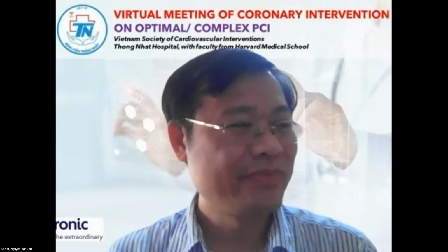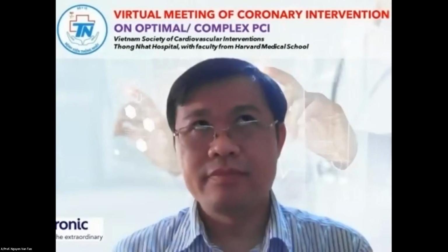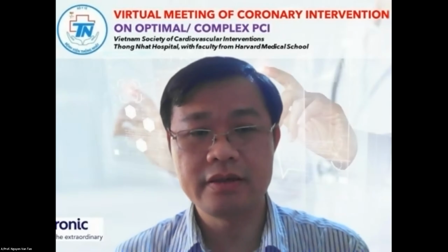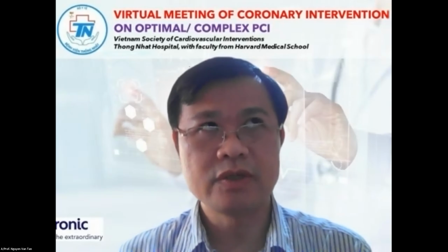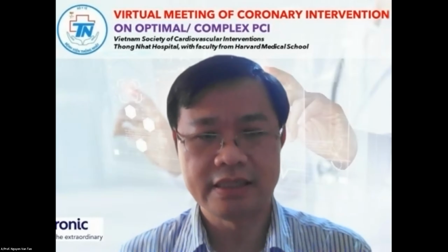So now, to do the OCT, in some situations be careful, because when we burst the contrast here intracoronary, the patient can go into VT. So be careful in some situations, especially slow flow or no reflow. We do not use the OCT.